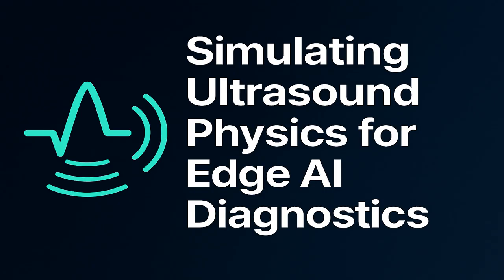Okay, so we've simulated the perfect echo, but reality is harsh. It is. That sound wave loses energy dramatically as it propagates through tissue, and if our simulation is going to be realistic at all, we have to accurately model this decay. Our sources break this energy loss down into three distinct, predictable pillars. And these three losses are the physical limitations we are constantly fighting against in ultrasound system design.